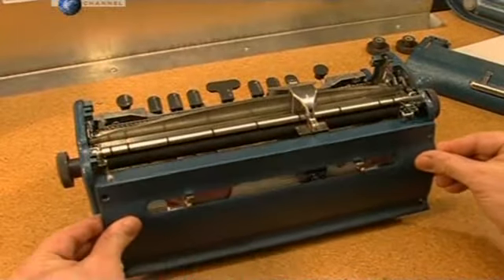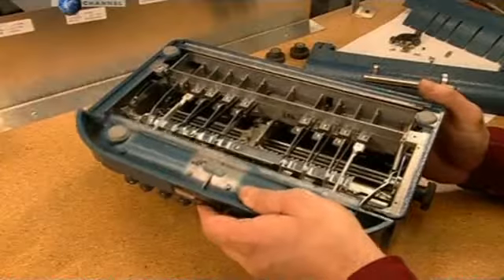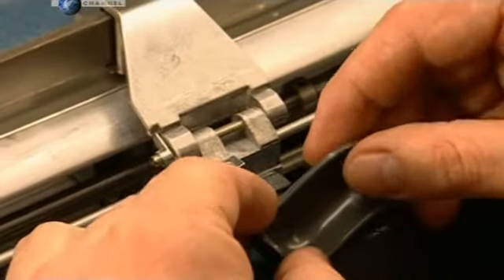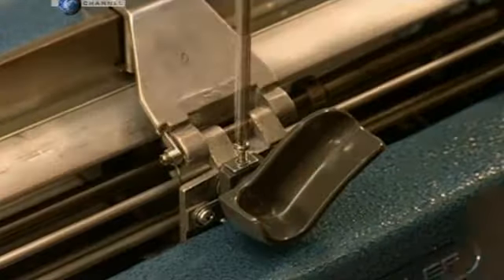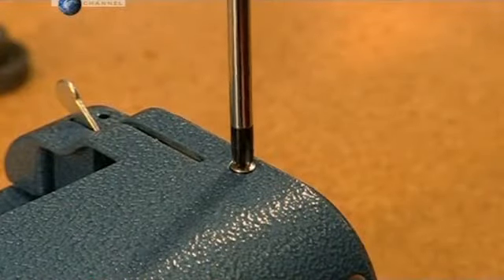The back plate has slots for the 2 levers that adjust the margins. The apron goes below the keys, the front plate above them. Then the last component, the carriage lever. When you type to the end of a line, you push this lever to the left to return to the left margin. You also push a key on the far left to advance the paper to the next line.